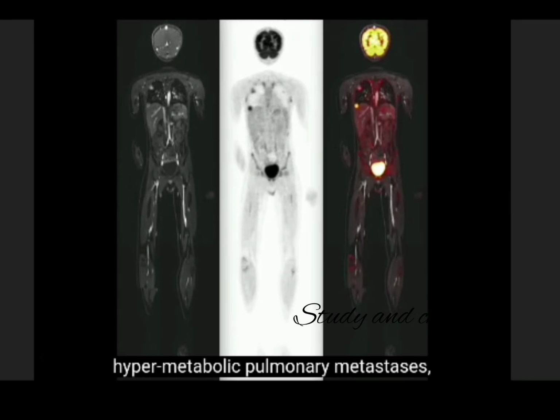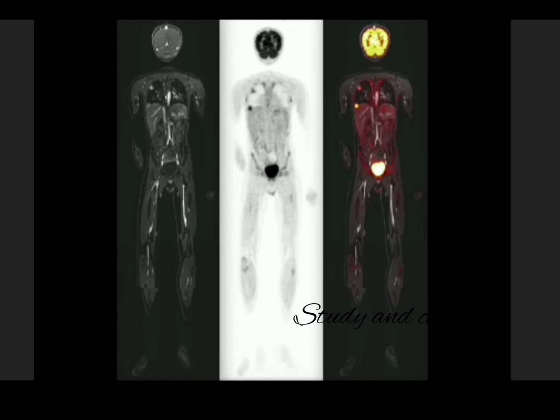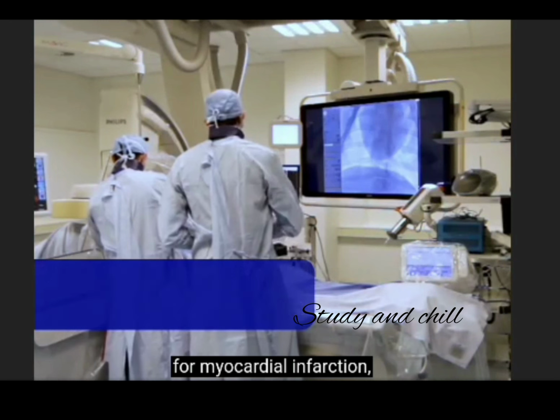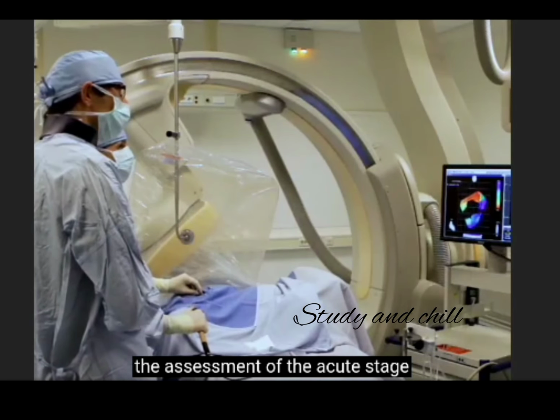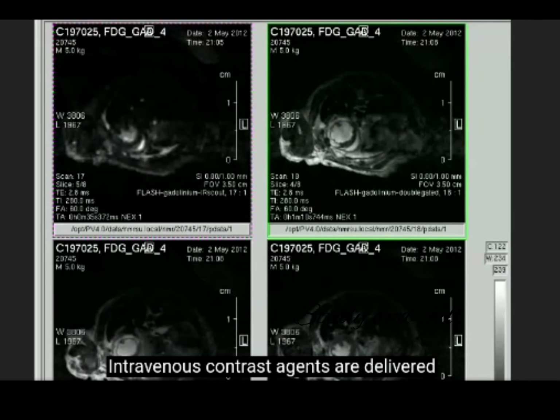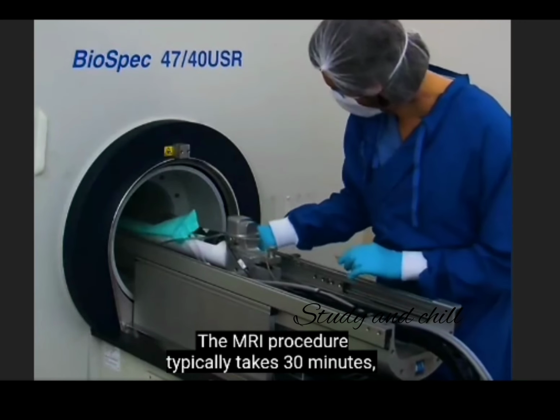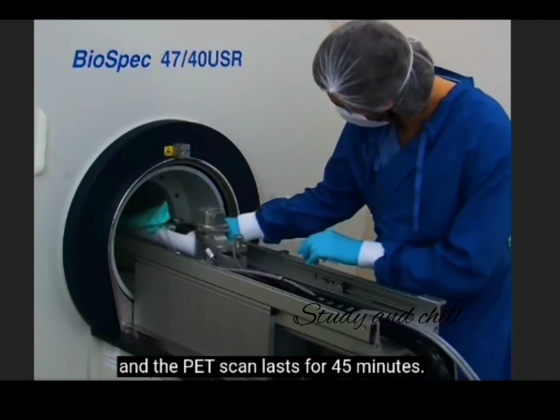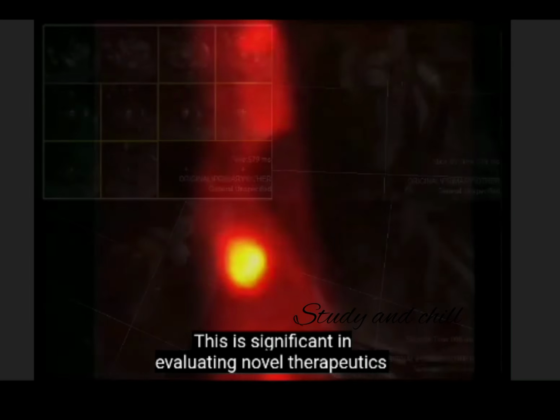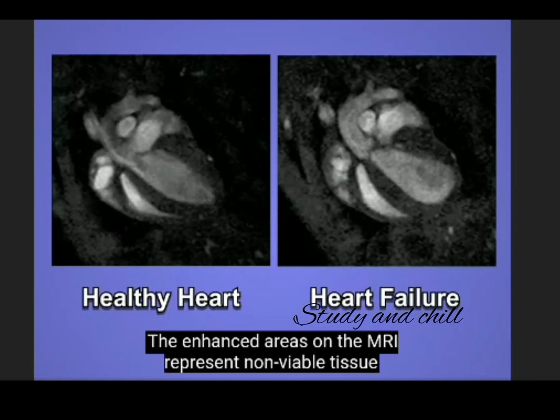To measure the efficacy of new treatment strategies for myocardial infarction, the assessment of the acute stage as well as long-term outcome is required. Intravenous contrast agents are delivered for the sequential PET MRI imaging of the mouse heart. The MRI procedure typically takes 30 minutes, and the PET scan lasts for 45 minutes. This is significant in evaluating novel therapeutics, because the time course may not be known. The enhanced areas on the MRI represent non-viable tissue and correspond to areas of reduced FDG uptake, which suggest potential coronary blockages or infarction.